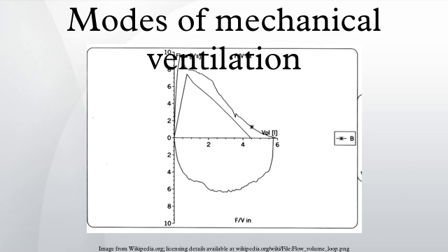Controlled mechanical ventilation in its original form had no patient sensitivity. A breath set was a breath delivered. Continuous mandatory ventilation was created out of the need for patient initiation of breaths. Fundamentally, continuous mandatory ventilation is controlled mechanical ventilation with a sensitivity for patient breathing.